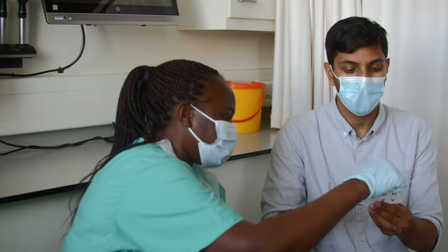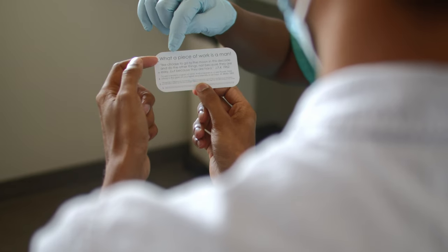Ask them to read down the chart with both eyes together. Record the smallest line they can read comfortably.